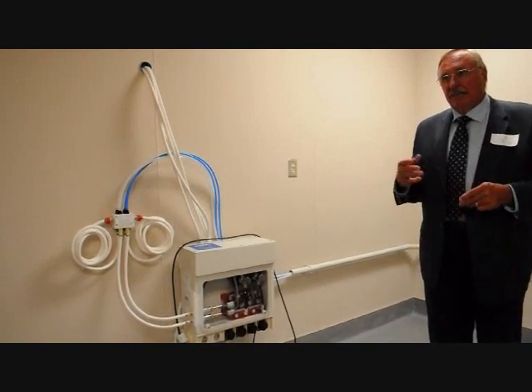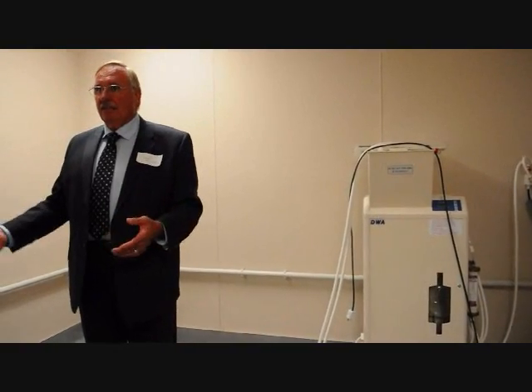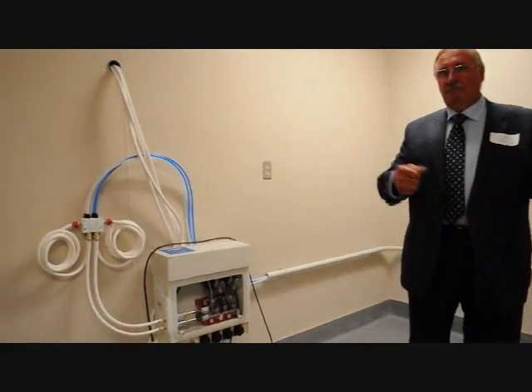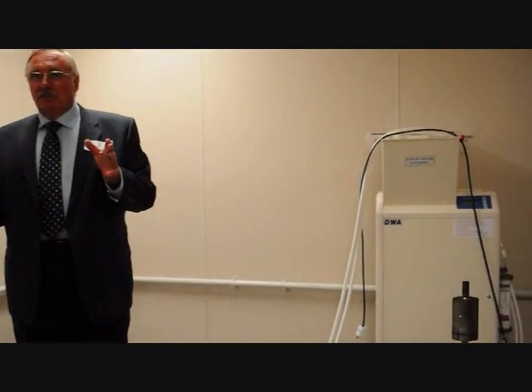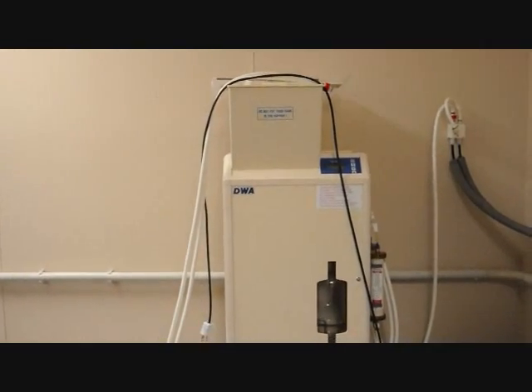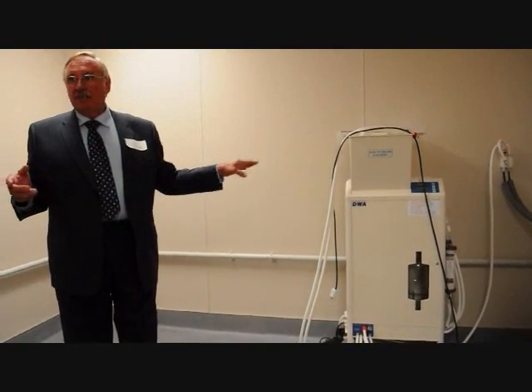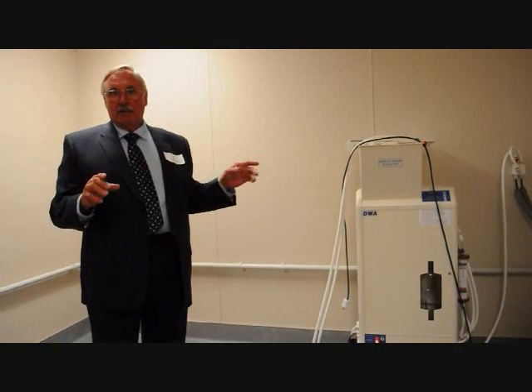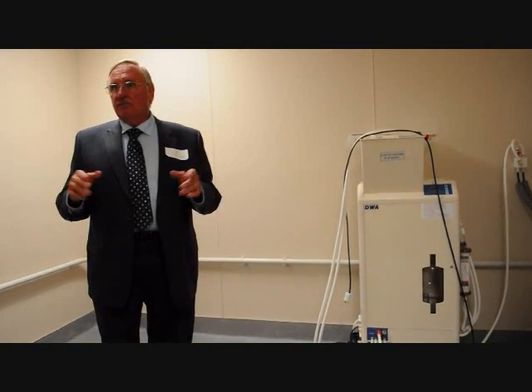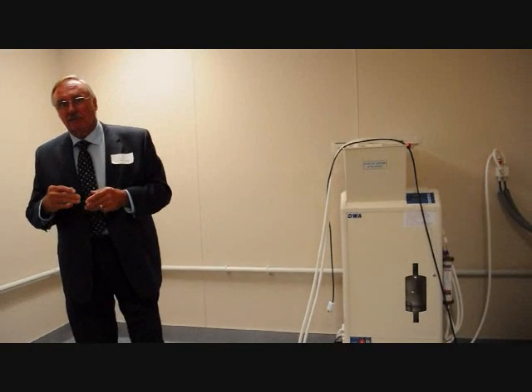And what these two machines do is they really save the nurses a lot of time, because in the past they had to carry around jugs of bicarbonate and acid and transport them. The other thing that it saves, especially the bicarbonate, is that what you used to do is mix up a bicarbonate bath jug or buy one that was already mixed, and then at the end of the run, for each patient run, you'd throw that away and start with a new one. This only makes what you need, so it doesn't require any of that. You make the acid and or the bicarbonate, and you use it, and at the end of the use, you use the next batch for the next person, but you don't have to throw away anything or waste anything, so it saves a lot of money.